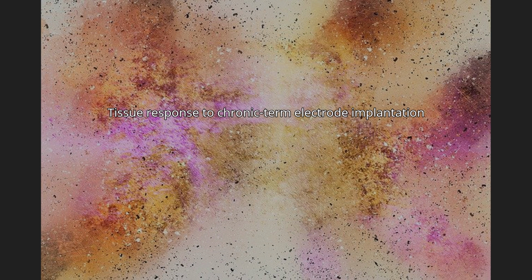material composition is resistant to such enzymatic dissolution, this frustrated phagocytosis contributes to the failure of recordings, releasing necrotic substances into the immediate vicinity and contributing to cell death around the electrode. Activated astrocytes form the major component of the encapsulating tissue that forms around implanted electrodes. Current theories hold that glial encapsulation, i.e.